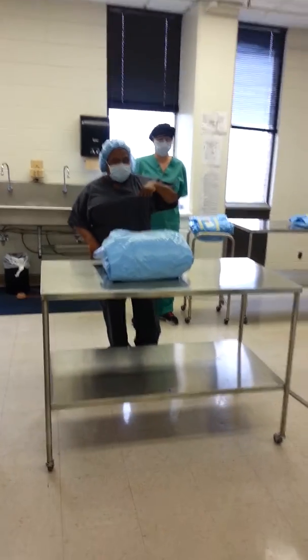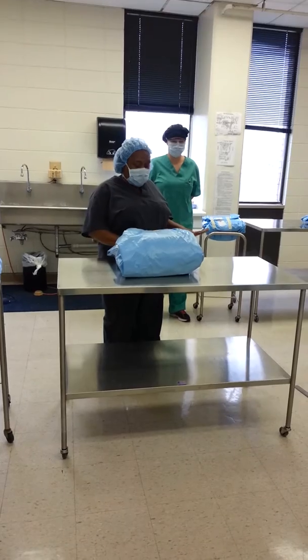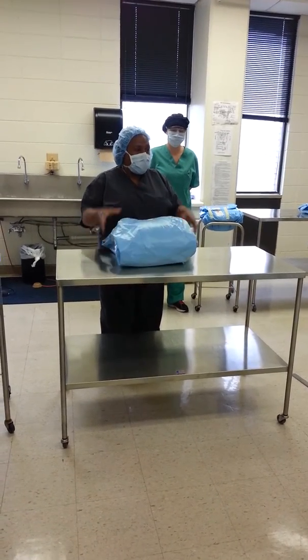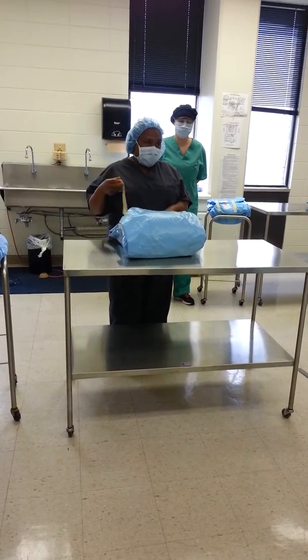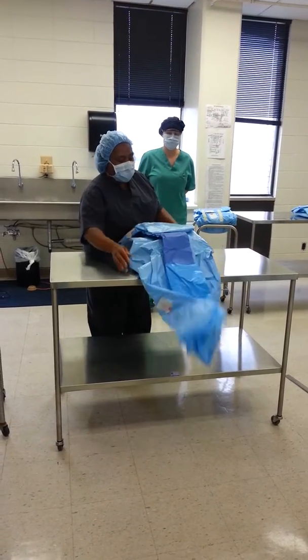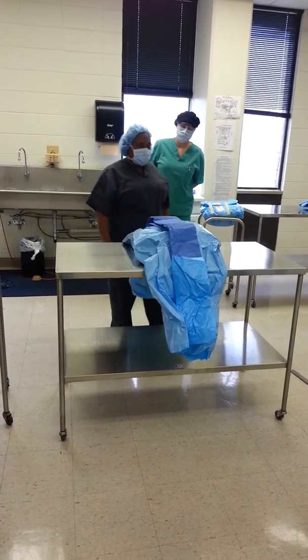And then you proceed to open up, and this is before you scrub, okay? Because this is not sterile, and the outer isn't sterile, only the contents. So once I scrub, gown and glove, I'm sterile, so I can't do this then. Make sense? Okay. So you always open away first, and then the last one is to you.